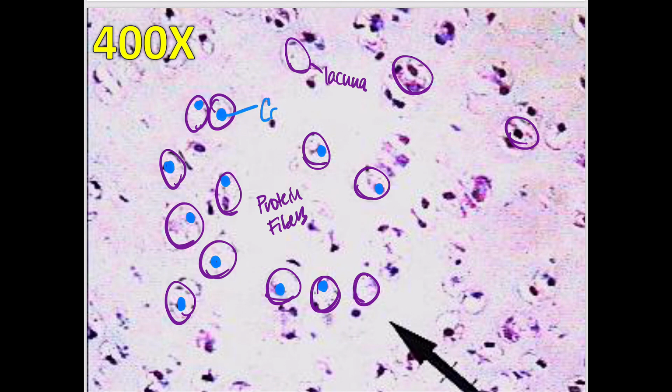All right, so these are cartilage cells, which have a special name, and I'll talk about that in a second. So that's essentially what hyaline cartilage is. It's very similar to bone. It's some cells, not that many of them, floating around in this kind of elastic protein.